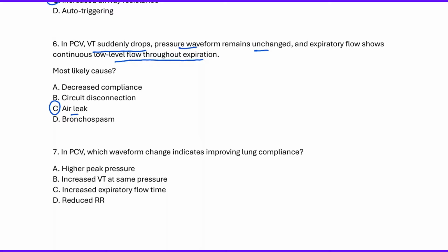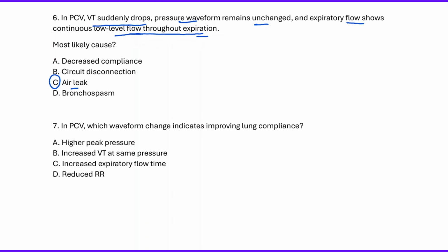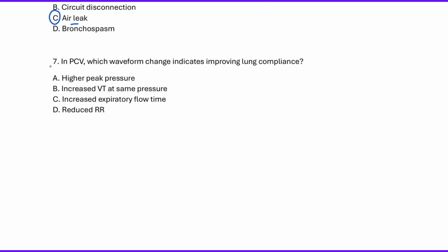So it would be a great example of air leak. So you can see there the pressure waveform remains the same, but it's the expiratory flow that shows continuous and low level flow throughout the expiration. So that would be a classic example of air leak. And let's go to the last question.